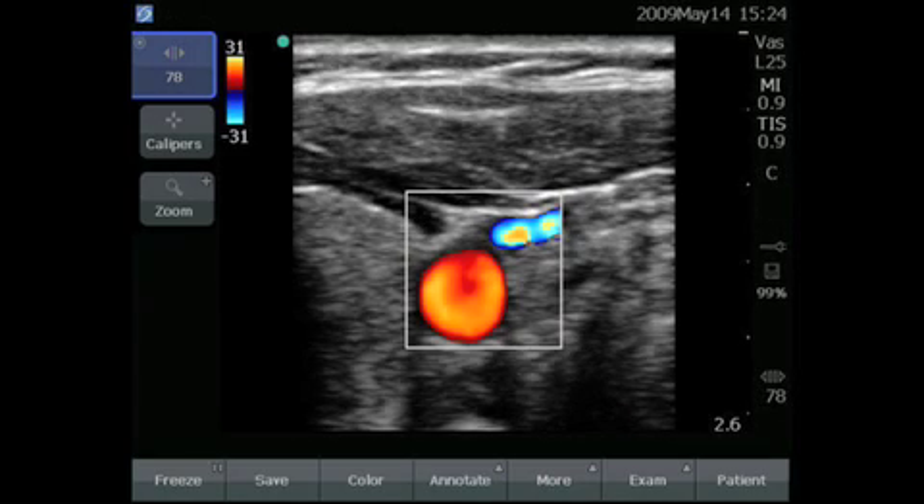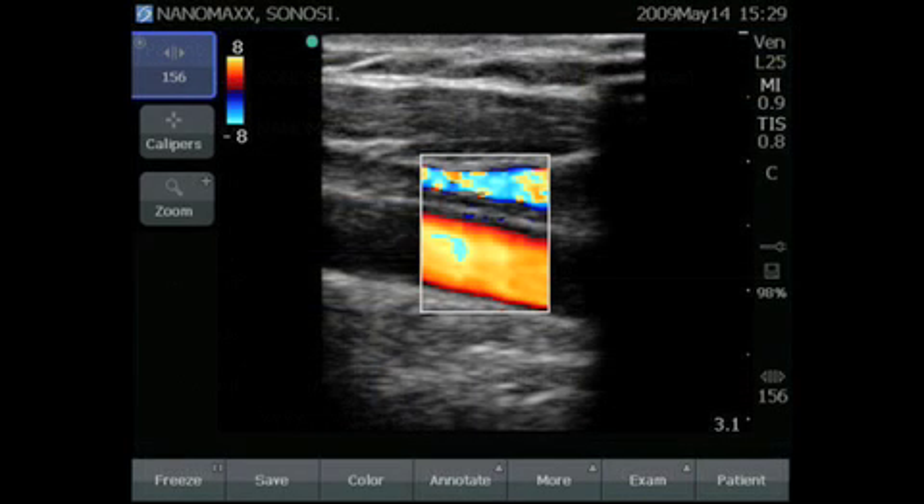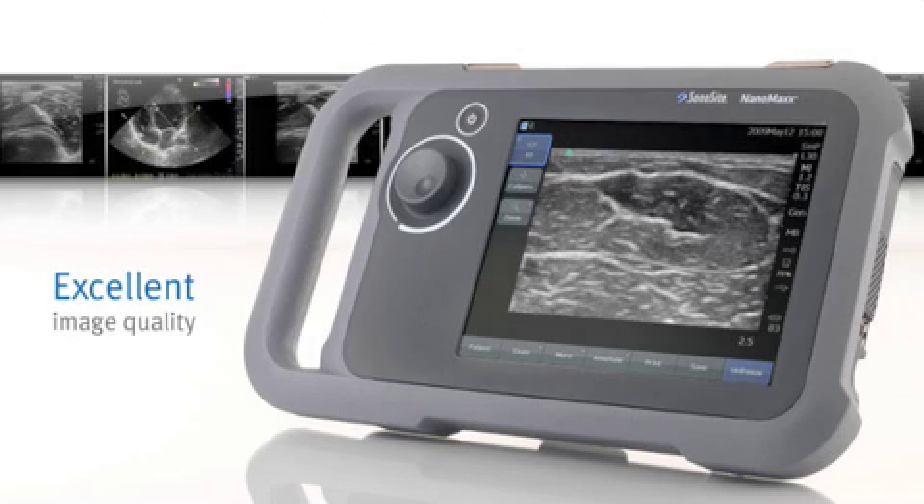These can be used to control items such as color, data entry, menu selections, and manage measurement tools. And just turn on the color flow to easily identify vascular structures. The images produced by the NanoMax are very impressive — it's remarkable that we get this quality from a product of this size.